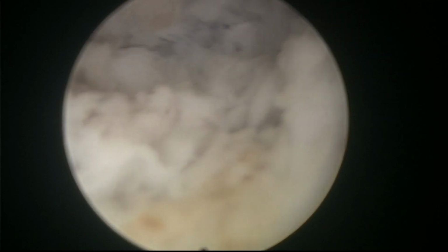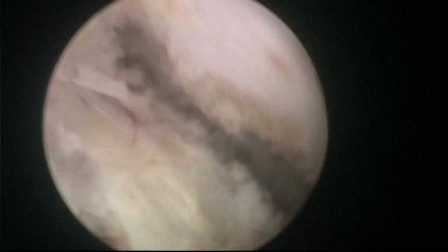You see, to a uniform depth. Here, let's come to the other side and continue with the dissection. It's a very large gland, but I have to say that doing these very large glands becomes much easier when you have a tool like pulse modulation, because you're much more relaxed and much happier in terms of the safety of what you're doing, the bleeding control. Of course, you see the anatomy and the detail much better, and the chances of having problems with the depth of the dissection or not recognizing the plane are diminished.